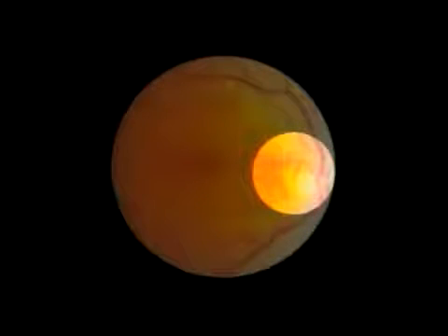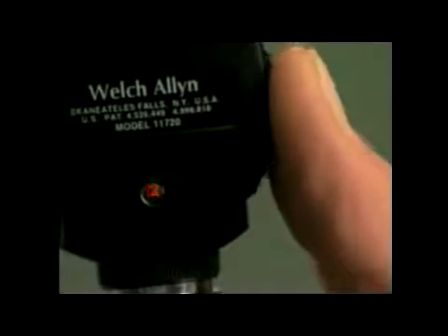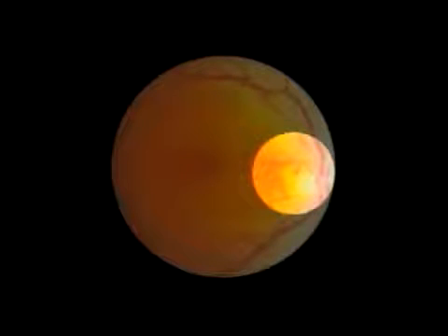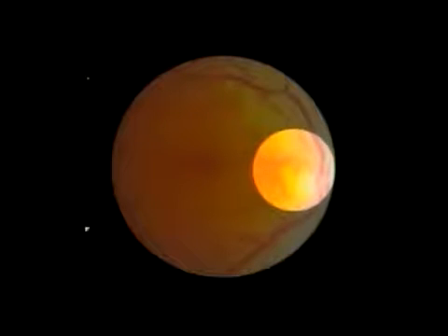Rotate lenses until the optic disc is focused clearly. The hyperopic or far-sighted eye requires more plus or green-numbered lenses for clear focus of the fundus. The myopic or near-sighted eye requires minus or red-numbered lenses for clear focus. Examine the disc for clarity of outline, color, elevation, and condition of the vessels.